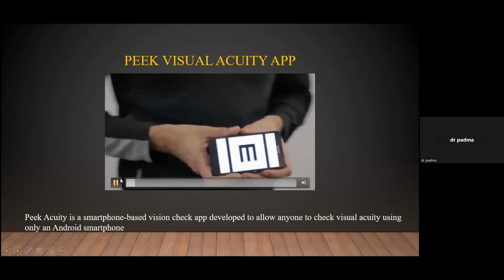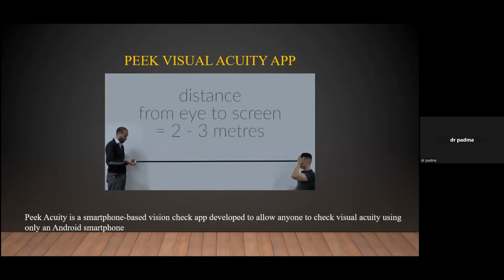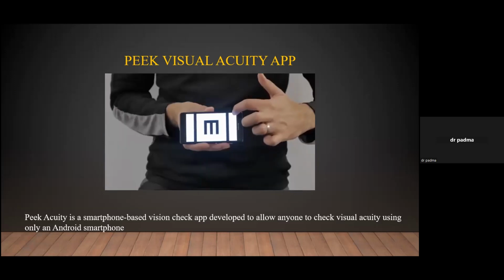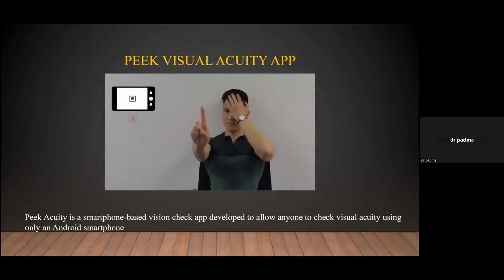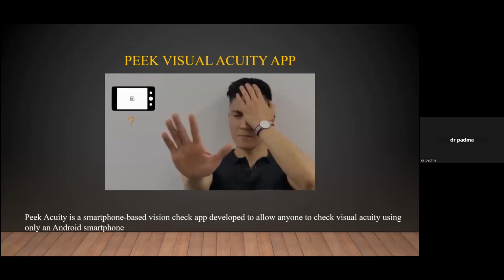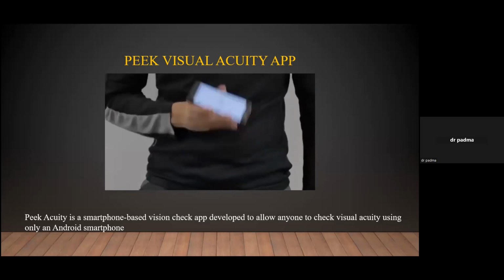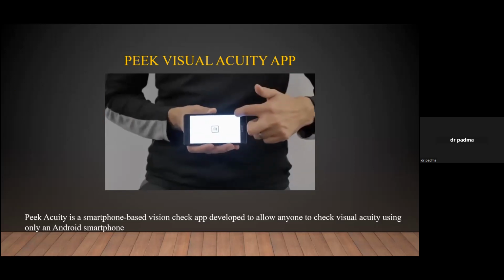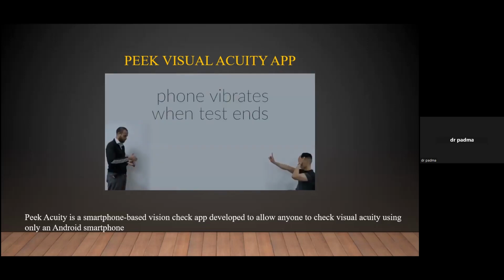So the left eye is covered, and the examiner stands 2 to 3 meters away, and makes sure to hold the phone at eye level. The letter E is shown on the phone, and the examiner swipes the phone screen in the same direction as the patient points, even if the answer is incorrect. If the patient says he cannot see, then the phone is shaken to record this. So we watch only the patient's response, and there's no need to look at the screen. The phone will finally vibrate when the test ends, and it also gives a score, and this can be used at bedside.